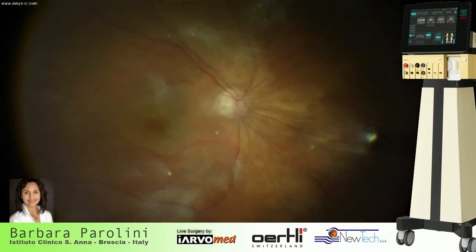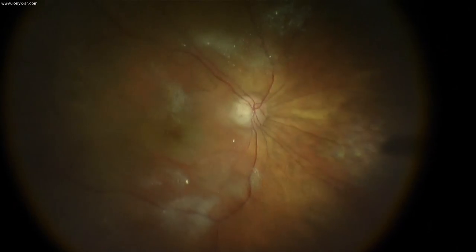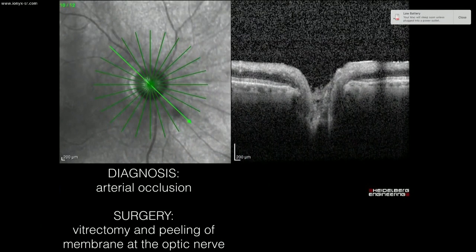So I was suggested to peel the ILM around the optic nerve. You can see in the image, the OCT image of the epipapillary zone with some hyper-reflectant material on top of the papilla. And I have to make sure to peel it off, starting with the peeling of the ILM in the peripapillary zone.